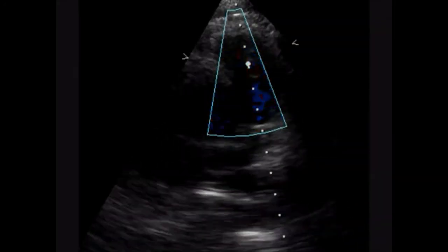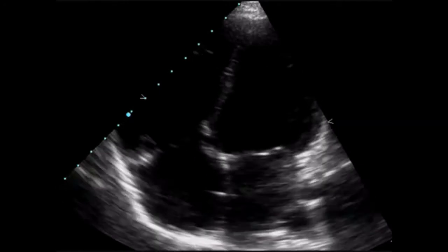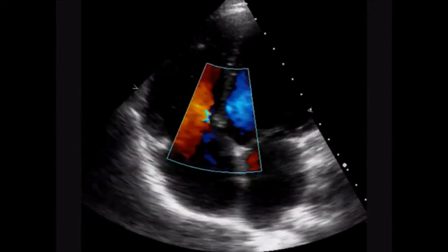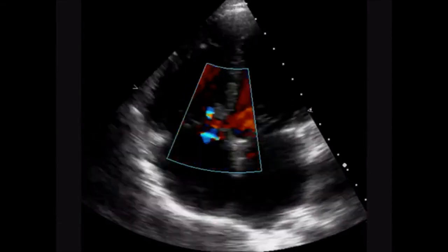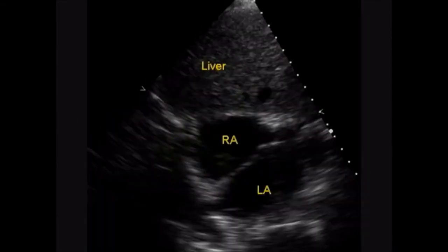This is the pulmonary flow after repair — good flow. And this is the apical four chamber view showing all four chambers. Now we have a four chamber view showing the tricuspid regurgitation which is persisting.